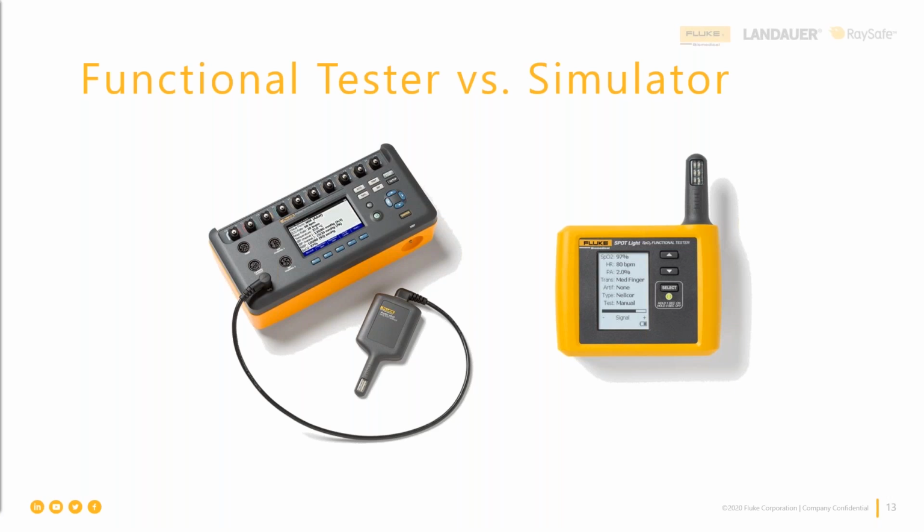Fluke Biomedical calls these devices functional testers because that's what the FDA calls them. Fluke does list them in its catalog along with its patient simulators. However, don't be fooled. The ProSim Spot is an accessory to a patient simulator, but it is itself a functional tester. If you want to learn more, there is a Fluke Biomedical white paper called "There's No Such Thing as an SpO2 Simulator" that's on the website. And it's a good read if you're interested in learning more about that.